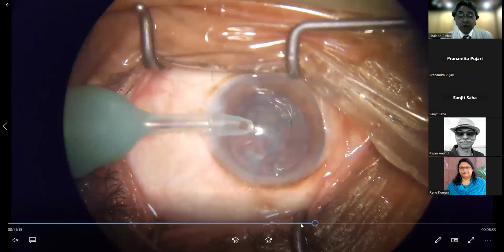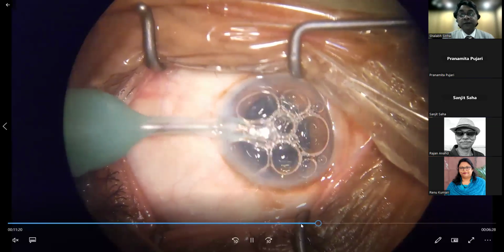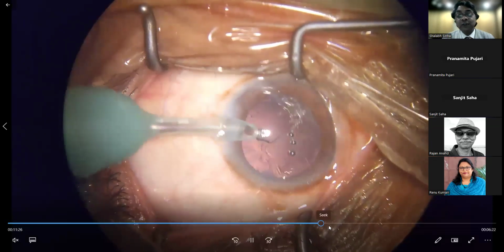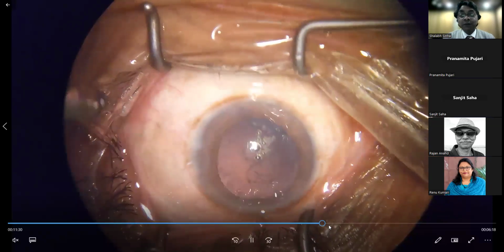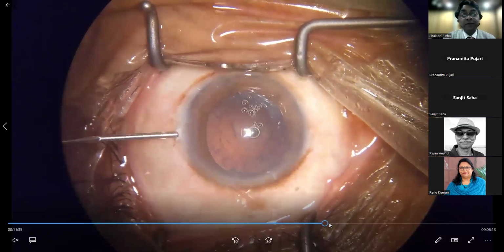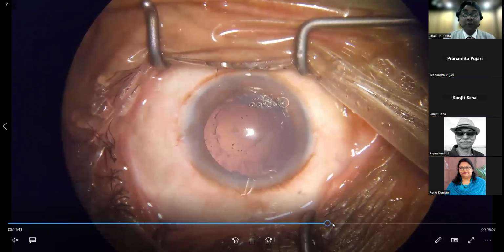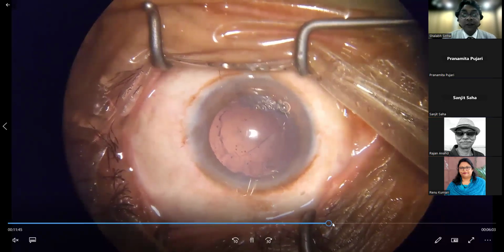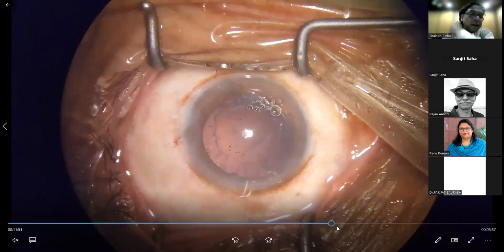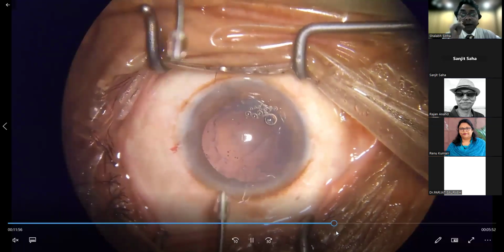So I'm not using any chopper in my left hand just so that there's no leak of fluid from the opposite end. This is what happens when you change the cassette or if you change the bottle, some air bubbles do go inside. So in this case, luckily, the nucleus is out, and what I usually do is inject viscoelastic from the opposite end, but here I hadn't done that. But still, viscoelastic being placed in the anterior chamber, and now we will do bimanual irrigation aspiration.